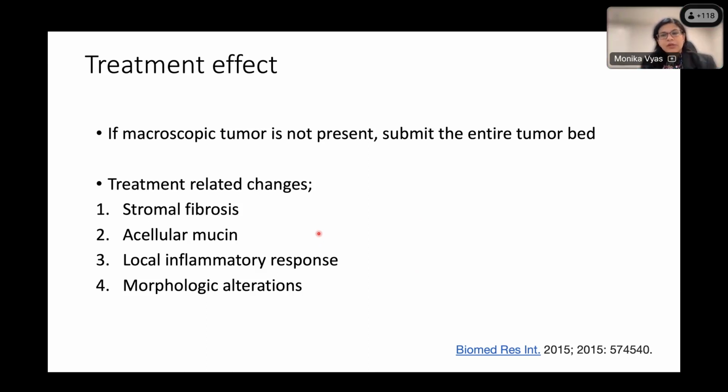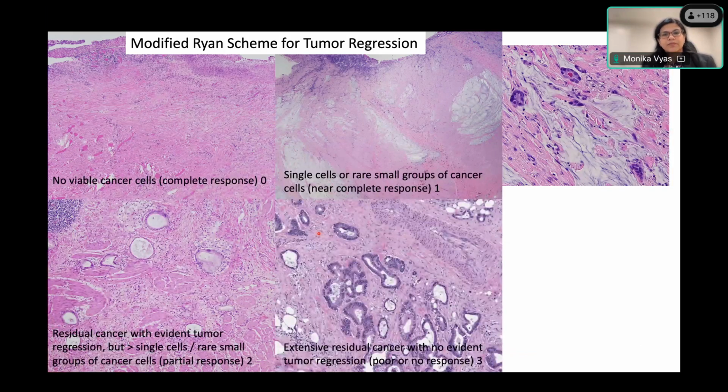So there are various schemes for doing a tumor regression evaluation. So we follow the modified Ryan scheme. There's the CAP one and MSKCC one, and you can choose whichever one you want based on your understanding with your treating physicians. So here we have a case illustrating complete response. So what you see is just this stromal fibrosis and inflammatory cells here. So you know that this is the right area. This is not your normal histology of the GI tract there, but we don't see any viable cells, so that is designated as complete response.